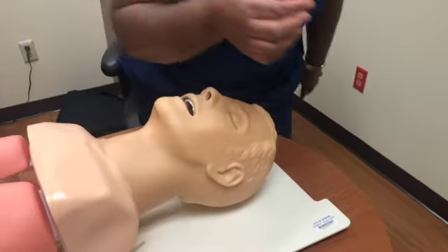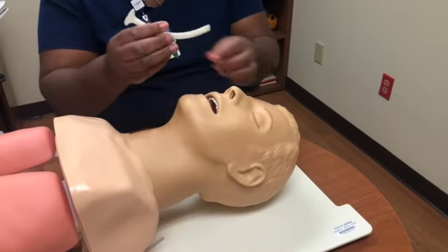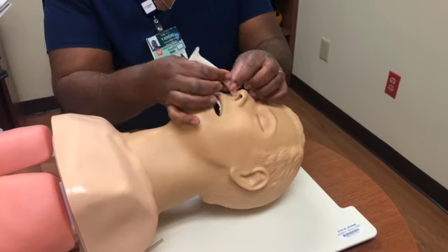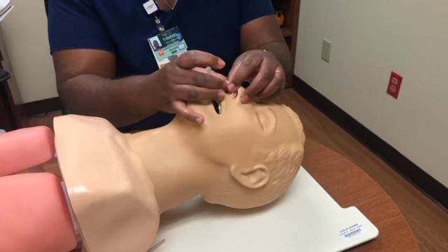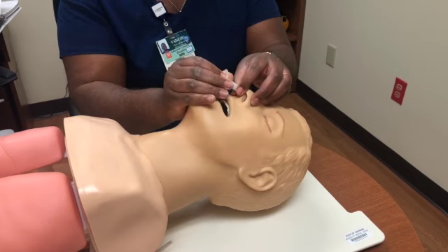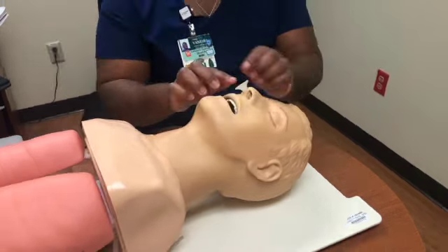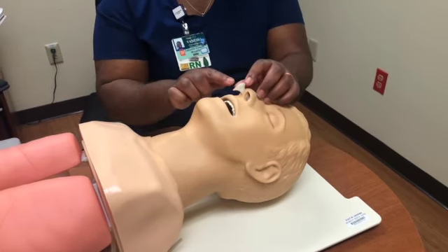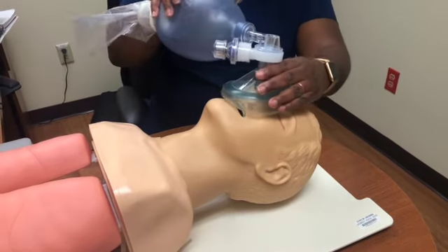When you're inserting it, you do want to insert bevel side up, and turn. If you meet any resistance, you can turn. If there's still further resistance, just go ahead and take it out and try the other nares. So once you have the nasopharyngeal airway in, from this airway, you can suction. You can also ventilate.